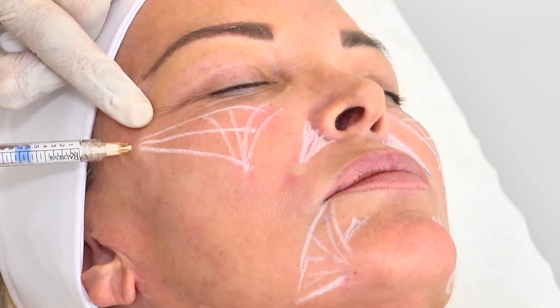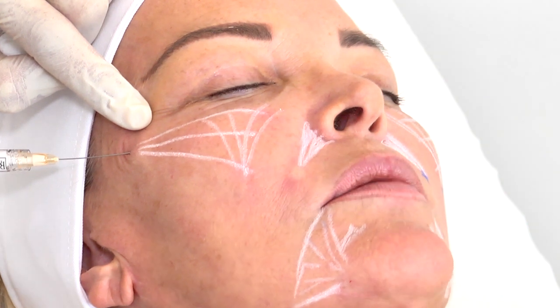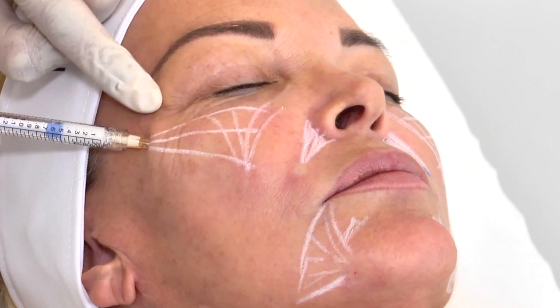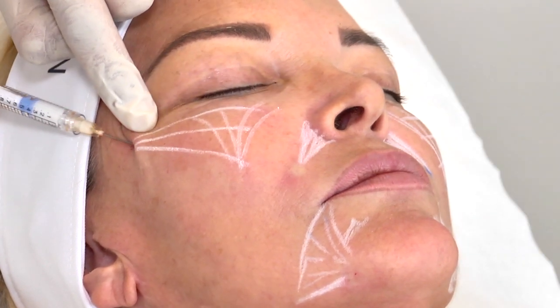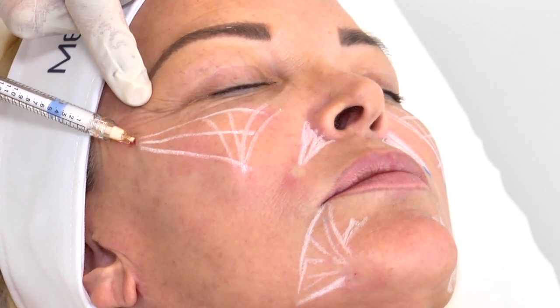Without removing the end of the cannula from the skin, change its direction and inject as many new lines as needed. The adjacent product lines are fanned out while limiting the number of injection points. Massage and shape the injected areas to evenly spread the product. With Radiesse, the product deposit and correlated correction are assessed immediately.